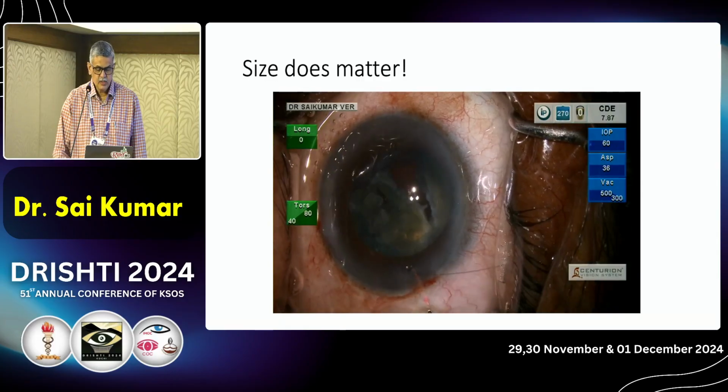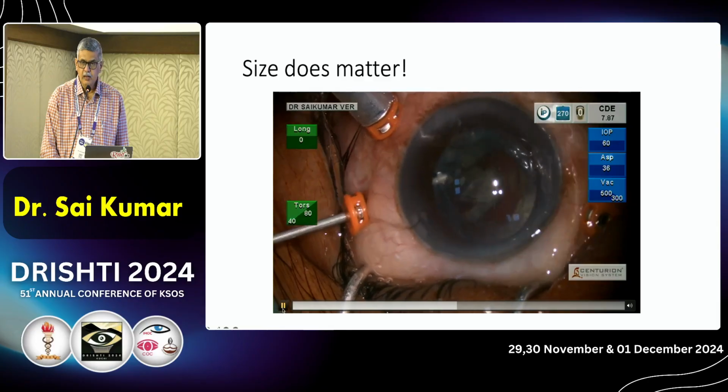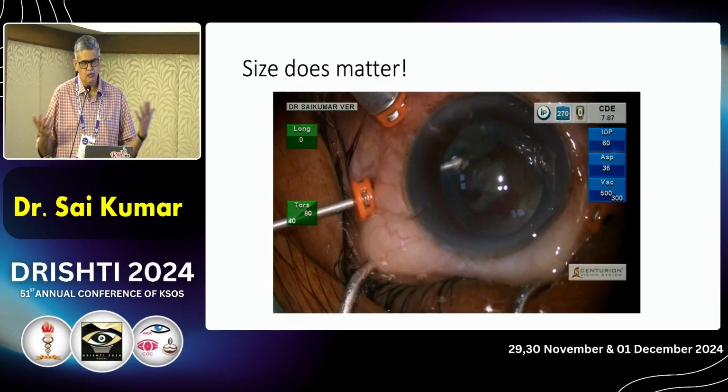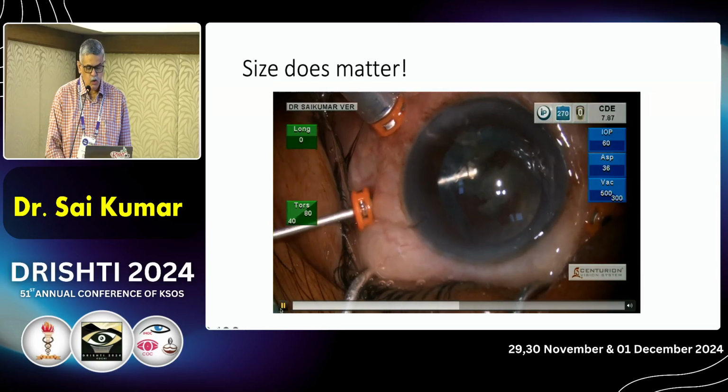Into the vitreous. So when you have this situation, please don't meddle with the piece. I think this has been emphasized many times for all of you. But the moment it drops to the mid vitreous and you have this feeling that somehow I'll take it out, you'll end up in a lot of trouble. So make sure that you call for help.